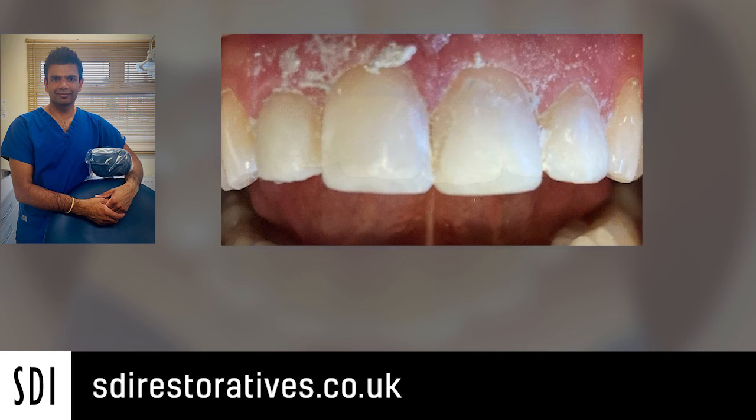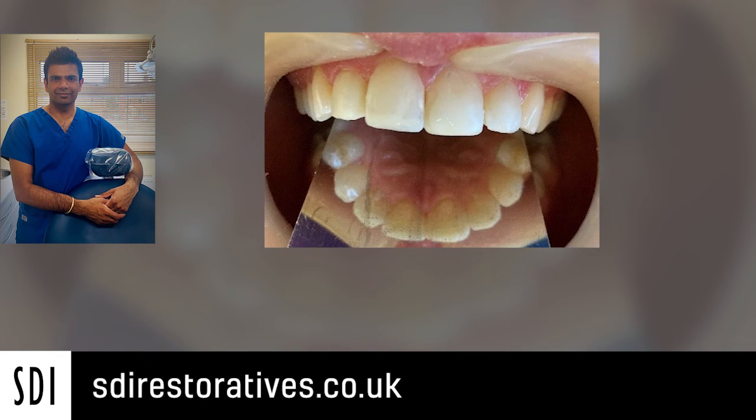The blow down is used periodically during the procedure to make sure that the tooth morphology is being recreated as closely as possible. This is a freehand technique so we're just using the blow down and the putty jig as a guide. Once we've built all three incisors we carry out the polishing of the composites using our generic rubber polishing cup system and then I usually finish off with a bristle brush.